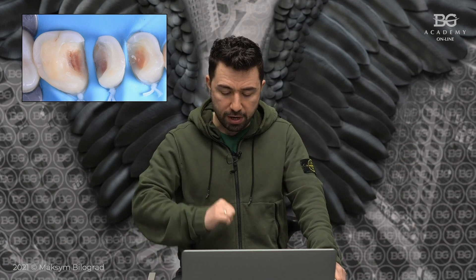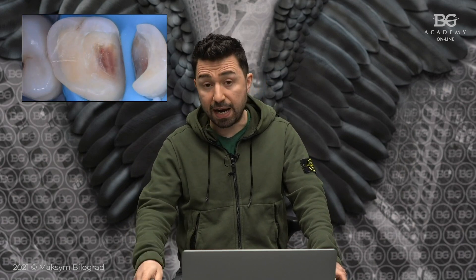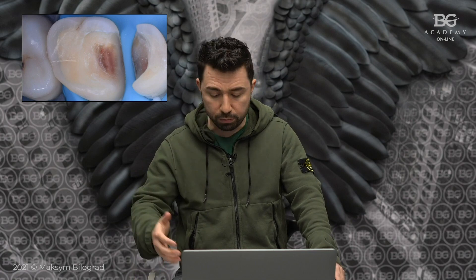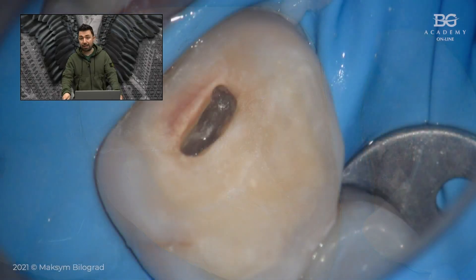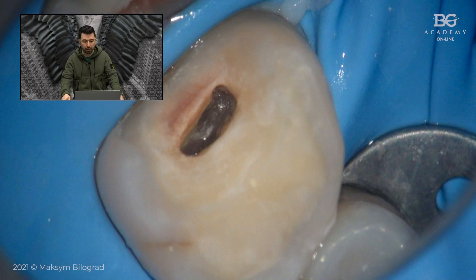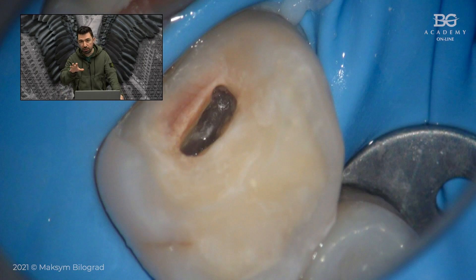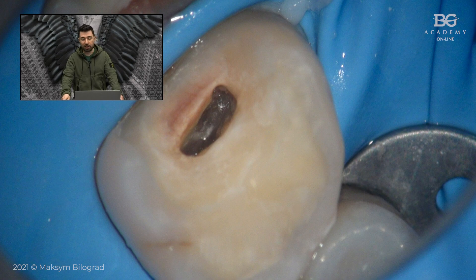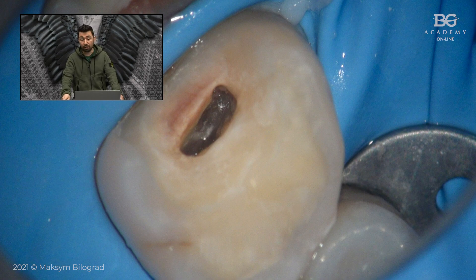Here you can see the magnified picture of the open pulp chamber. The pulp was necrotic in the mesial root canals; in the palatal canal it was a little bit alive. So actually, we were in time to provide that diagnostic procedure and begin root canal treatment.